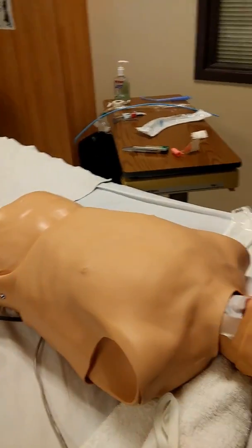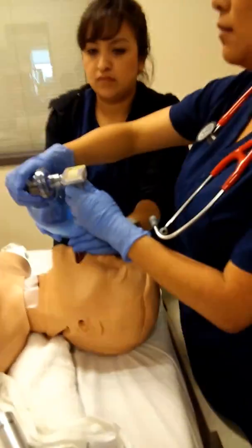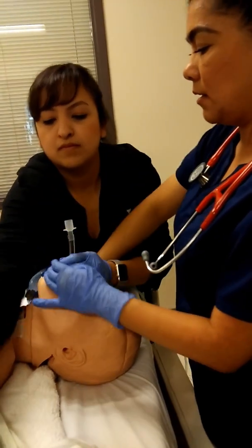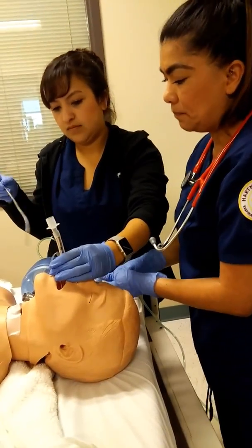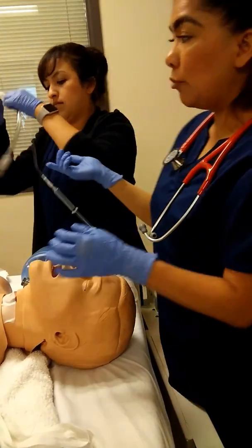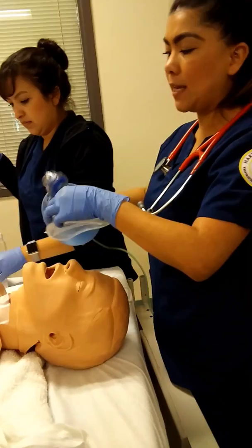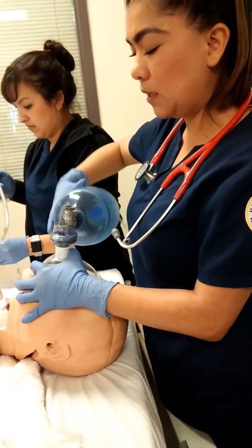So what I'm going to do is remove the bag, and I'm going to deflate. Okay. We're going to remove this. We would be obtaining a new tube.